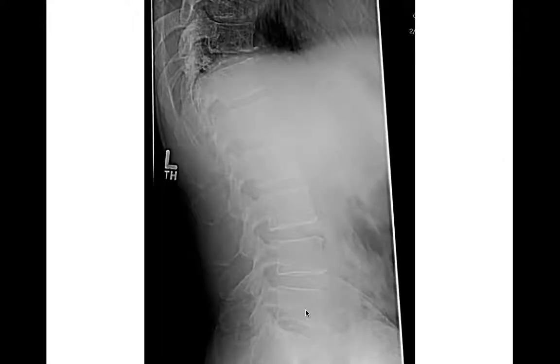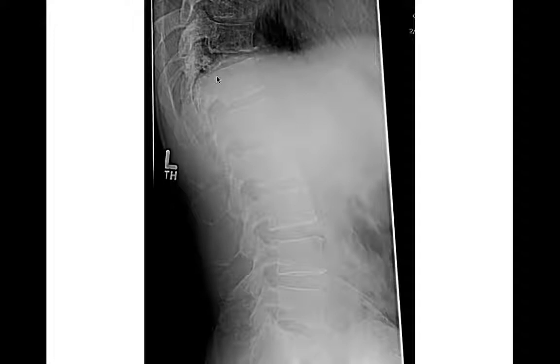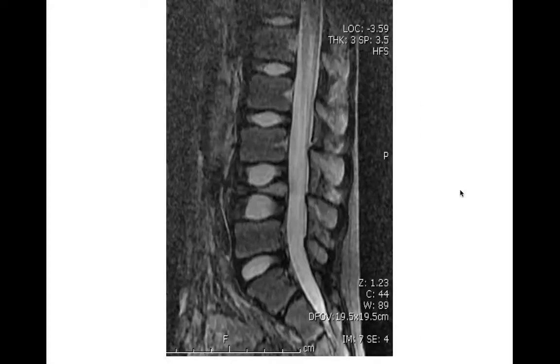Next, a brief differential for vertebra plana deformity. Here's a radiograph showing a vertebral body which is nearly completely flattened, with focal kyphosis — a nice example of vertebra plana. There is a classic differential diagnosis for vertebra plana. This one was multiple myeloma, which is one of the differentials on your list.